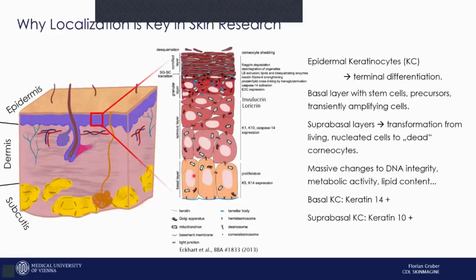We have here a basal layer of cells, and there are also stem cells and precursors for the keratinocytes of the epidermis.